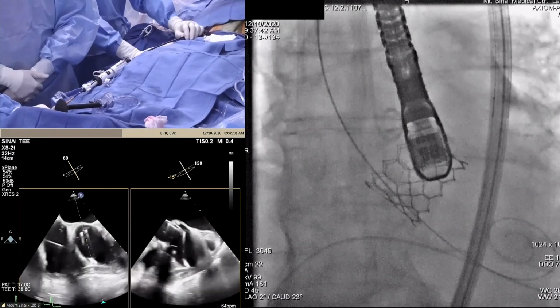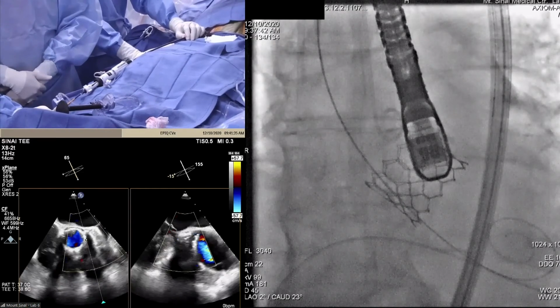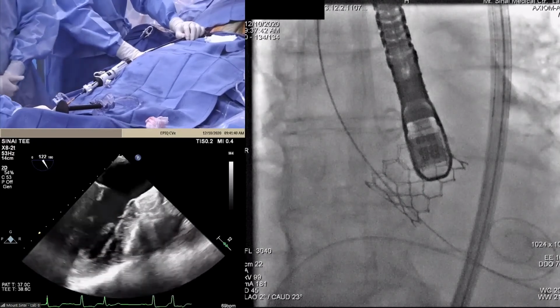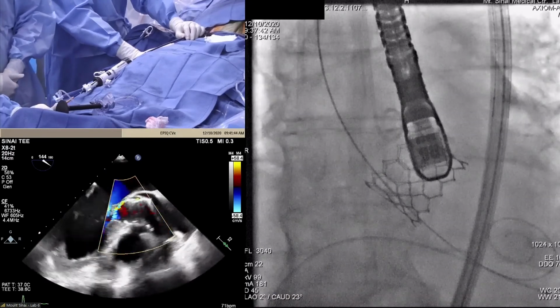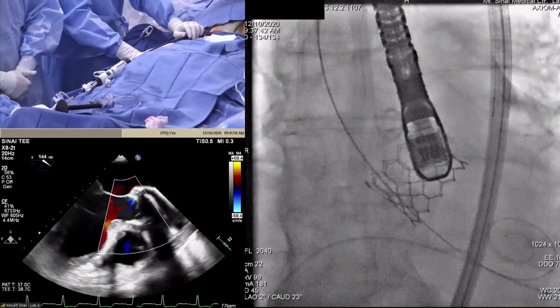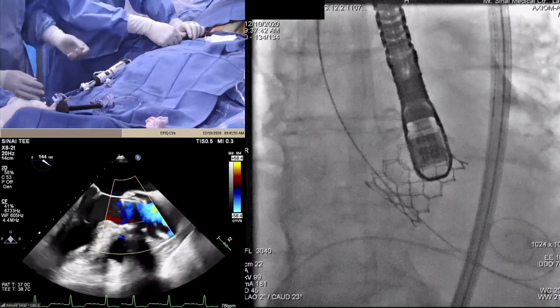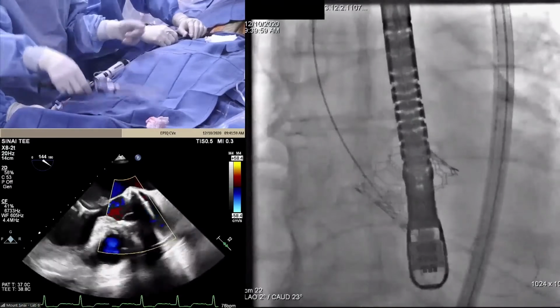Yes, speak, please. Can you see the long axis? So I say it's mild, good mild paravalvular leak. Now, since we know the annulus is benign and no risk of perforation, either we can post-dilate. We should go ahead and post-dilate. Let's put 2 more cc's and we'll go again. Anybody on the panel please, would not do this.